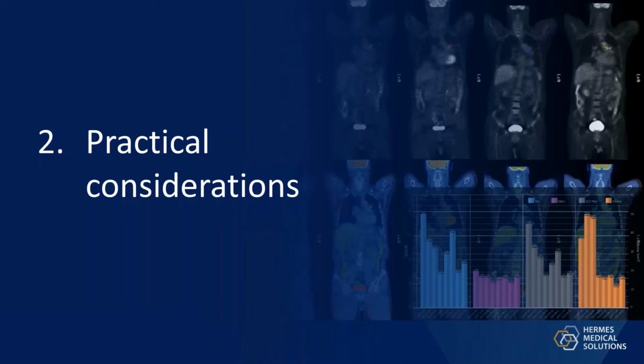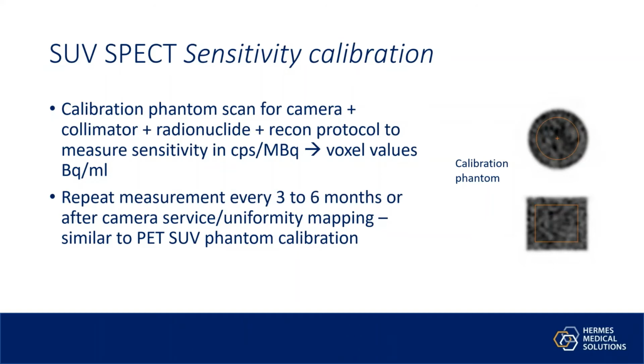Okay, moving on to some practical considerations. Sensitivity calibration. Once we are happy with the activity distribution of our reconstruction, then we can apply a sensitivity factor.